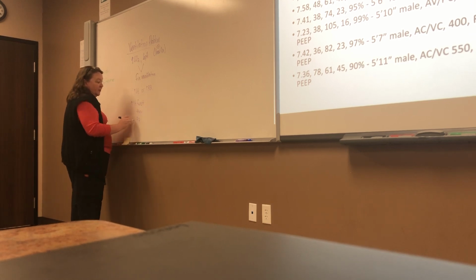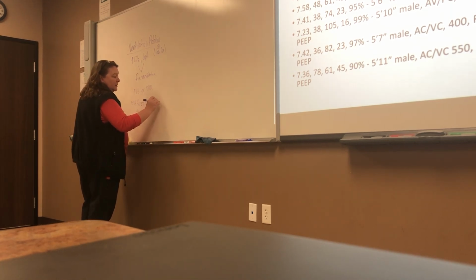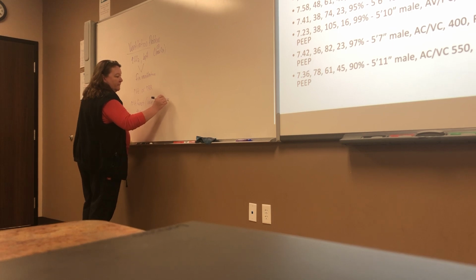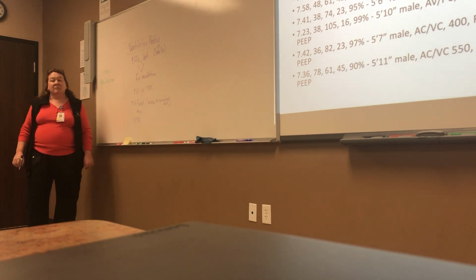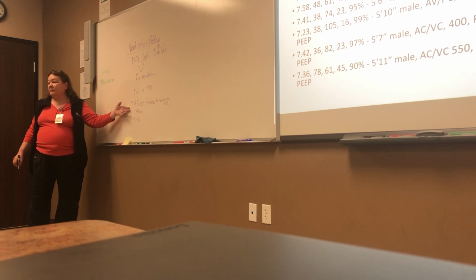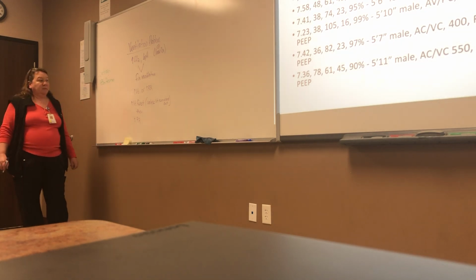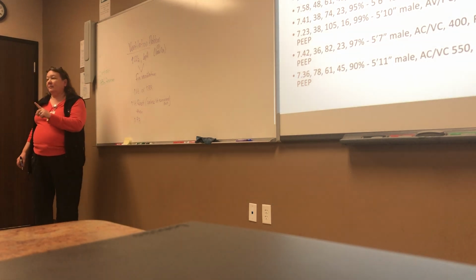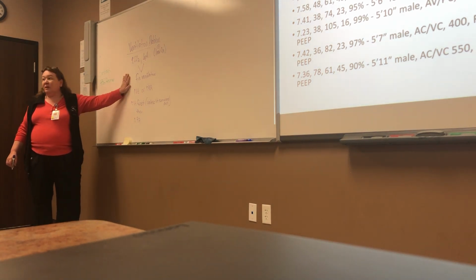Unless VT is maxed out. If your tidal volume's maxed out, go to your rate. If it's not maxed out, change your tidal volume. One of these only, not both. We fix one thing at a time, except for one exception, which I will clarify before we're done. Are there any questions on this?